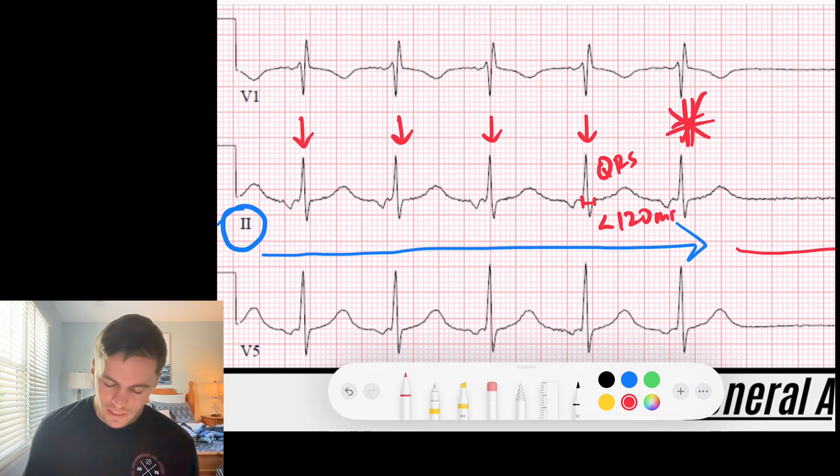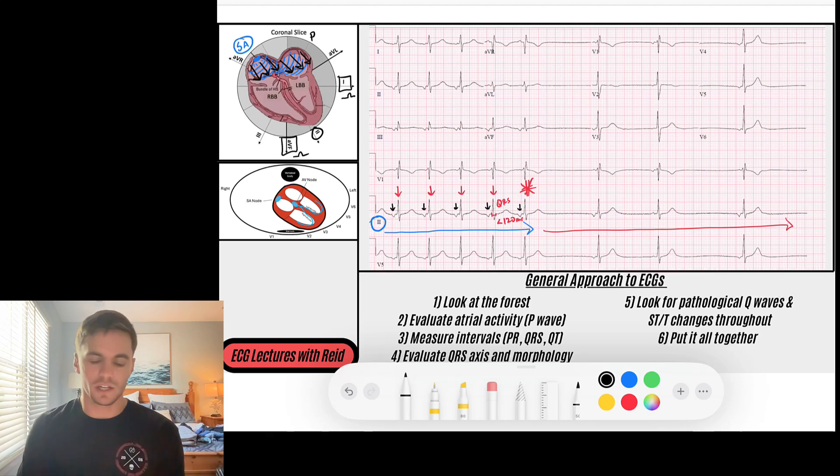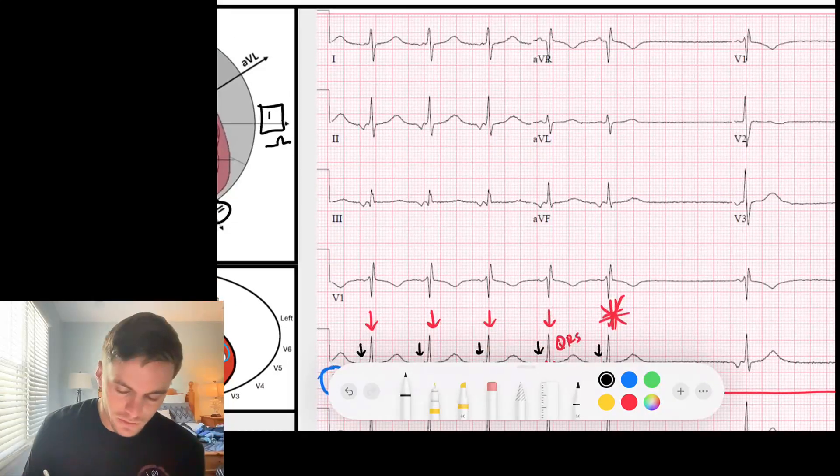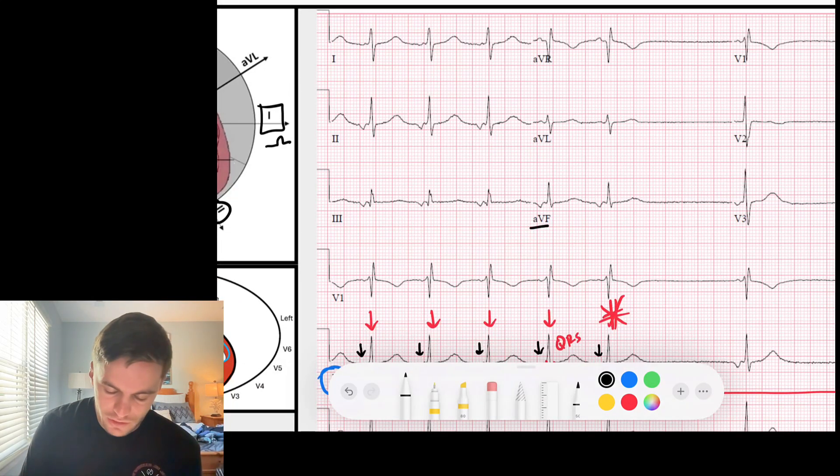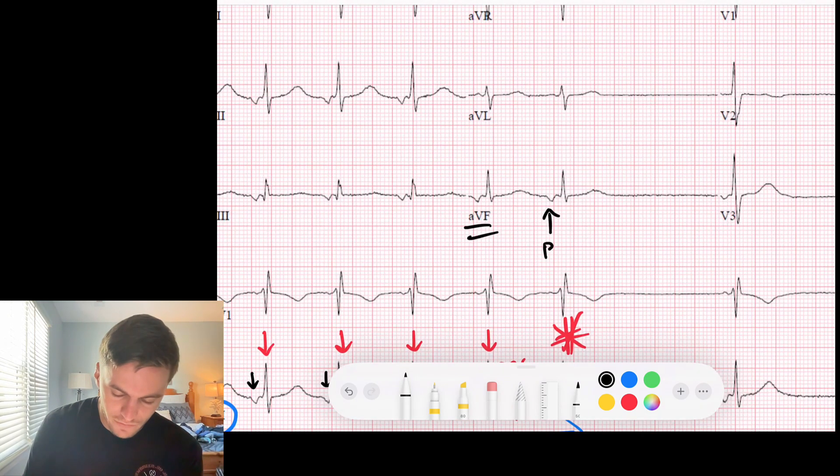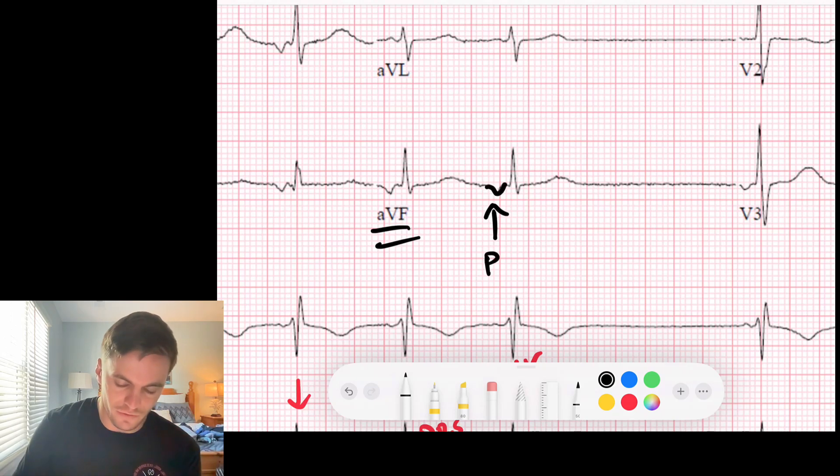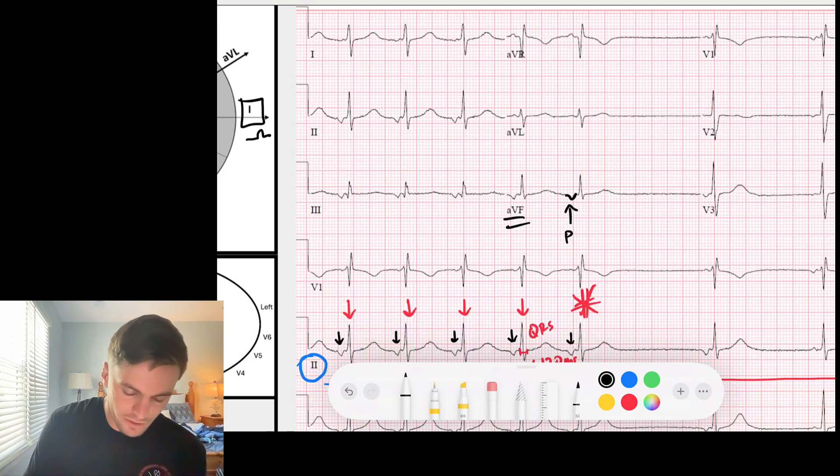I notice that before there's a nice narrow complex rhythm—these QRS complexes are narrow, meaning that the duration of the QRS is less than 120 milliseconds, less than three small boxes. That tells me that this QRS is being generated from at least the AV node down, because it's rapidly conducting through those His-Purkinje fibers. And so now I'm like, well what's driving this rhythm? And I see I've got these nice P waves that I'm noting in black right here.